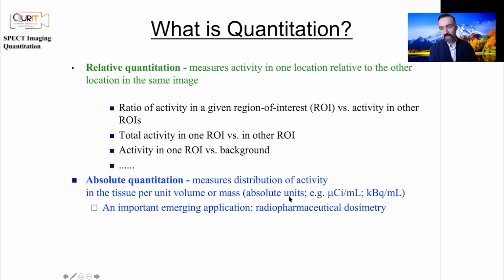And the way to do that often is with SPECT imaging, let's say in lutetium-177. So having absolute numbers is going to be important because you want to know exactly how much radioactivity is there, and from that you can calculate dose given to the tumors and organs.